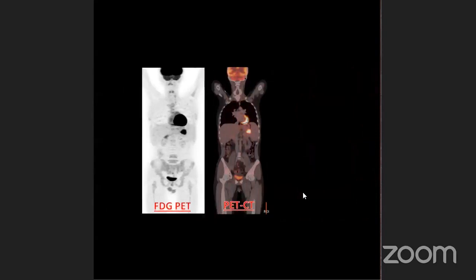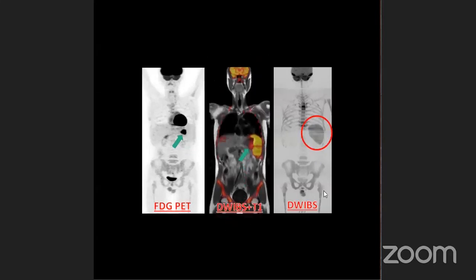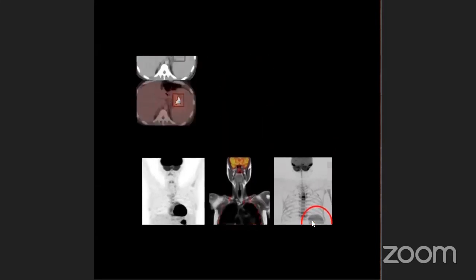This is just fusion between T1 and the diffusion. You can see that there are some similar colorful images as well. So this, again, is the PET-CT fusion, and here you can see the fusion of the MRI. This picture I took from my colleague Ayman. So these were real-life cases which he did. I did also some of them.